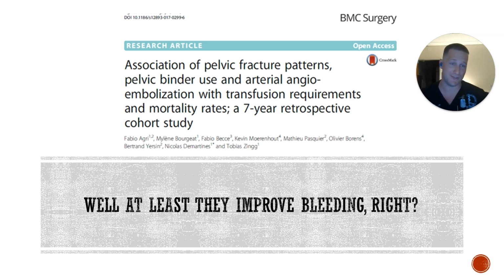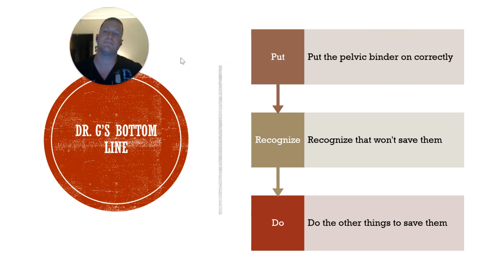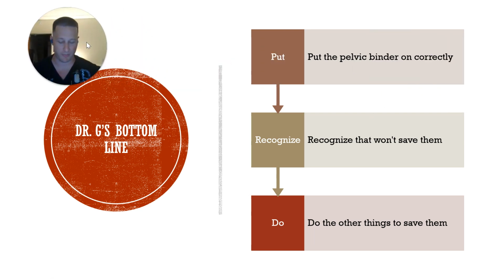But bottom line, it didn't change anything. So, what do I think about it overall? I think it's a shame that the pelvic binder has really poor data that supports it. So that's sad. I suppose overall I'm sad about it.